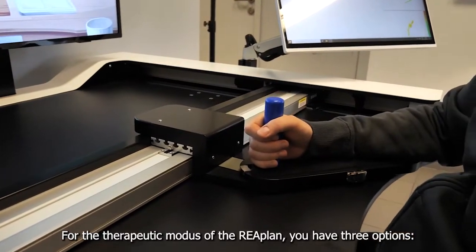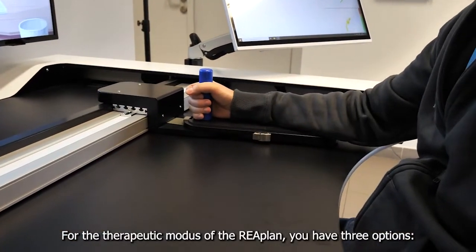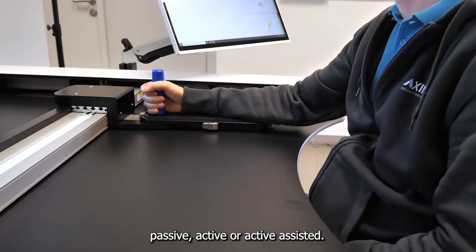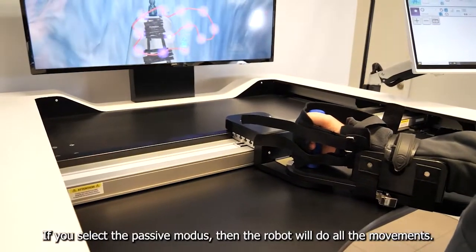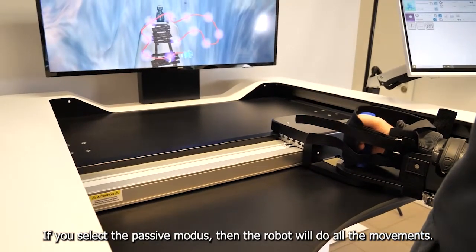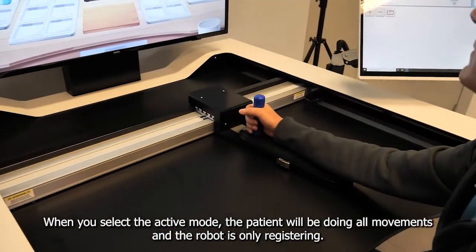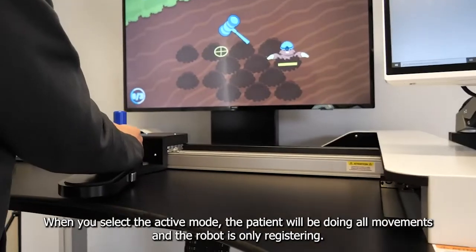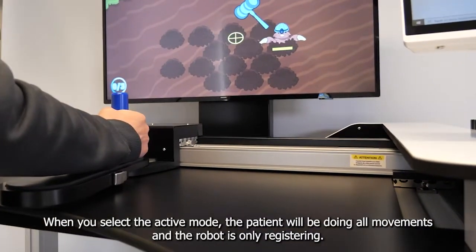For the therapeutic modes of the Reaplan, you have three options: passive, active, or active assisted. If you select the passive mode, then the robot will do all the movements. When you select the active mode, the patient will be doing all movements and the robot is only registering.